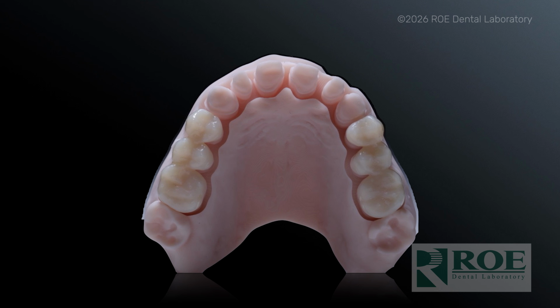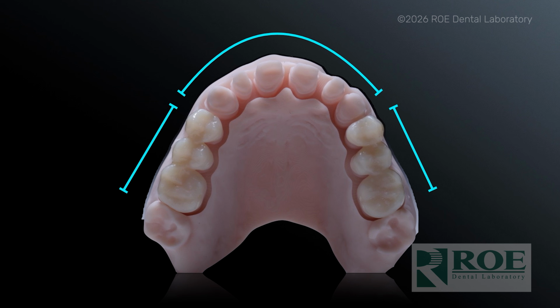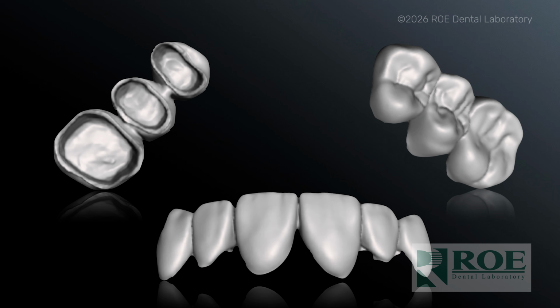In reality, you're going to get cases like this. So we're going to break it up into sextants. If I'm doing full arch, I do the anterior 6 and then the posterior quadrant or sextants there. If I'm doing the anterior 8, which is a lot of my cases, 8 to 10, then I'm usually keeping premolars, canines 1 unit, and incisors 1 unit, and then premolars, bicuspid, cuspids as a unit. And so this is great because then your lab is going to send it like this. And like I said, if you take anything away from this, do not ever split this down the middle on 8 and 9. I know you'll be tempted, but I promise you, they never look good. They always look weird.